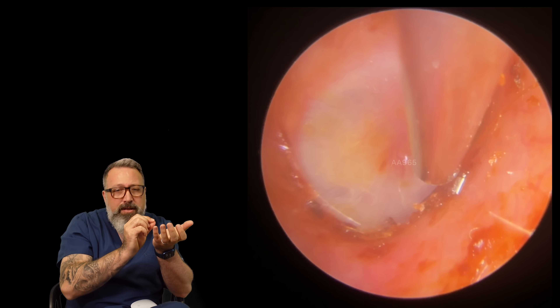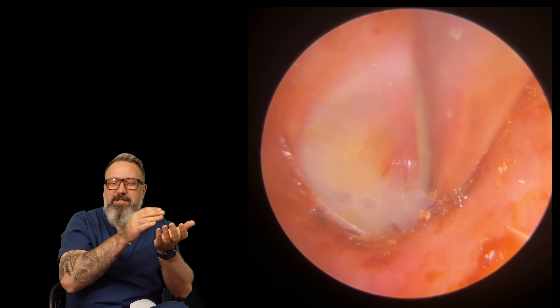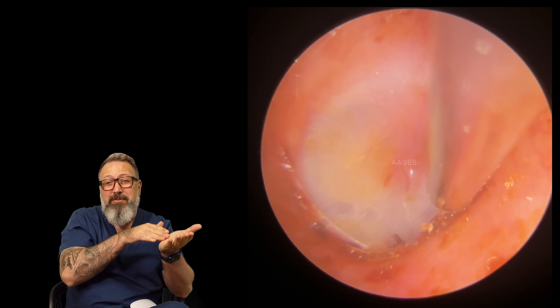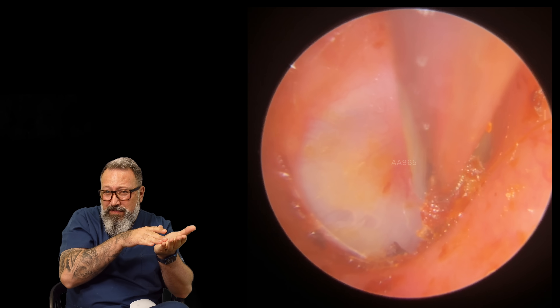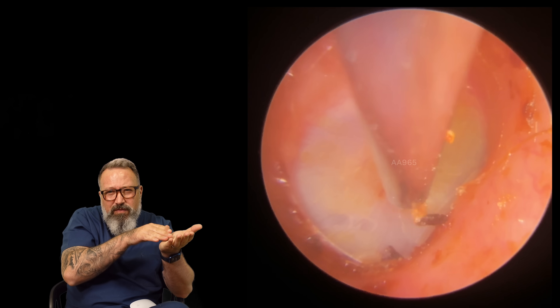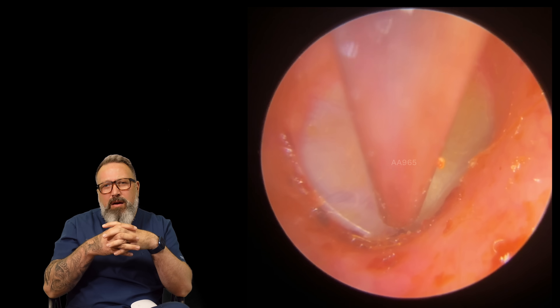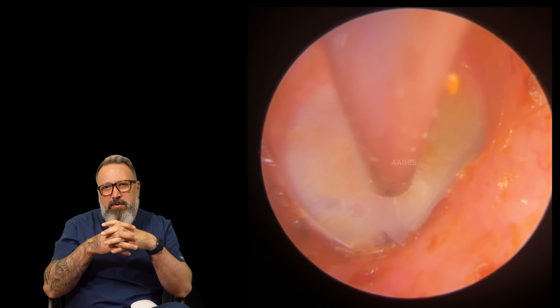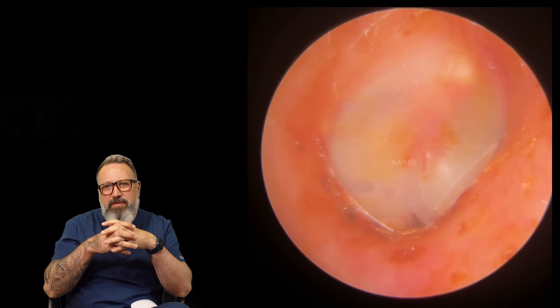Taking these thinner pieces off now - if I've got a very very thin section that is literally paper-thin, sometimes I'll leave it because trying to remove it would almost scrape the skin and the patient would be very uncomfortable. I'll just hover over the top and flick up the larger pieces. There we go - eardrum looking lovely and healthy.